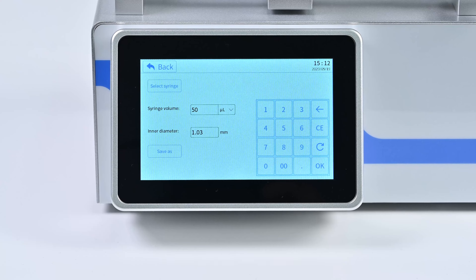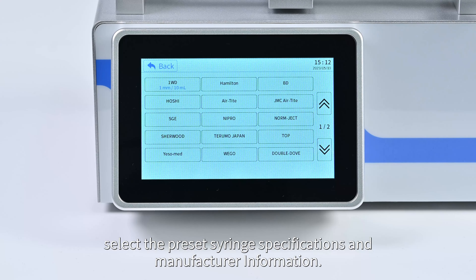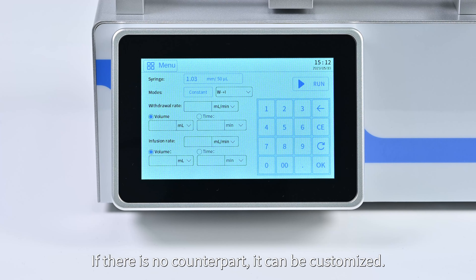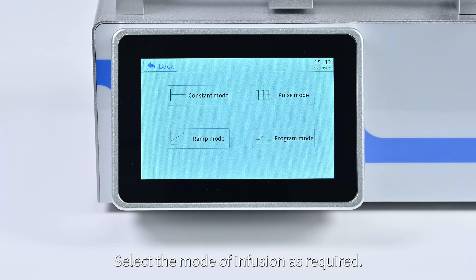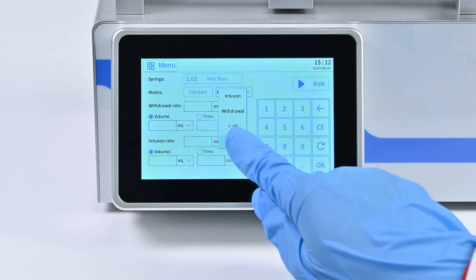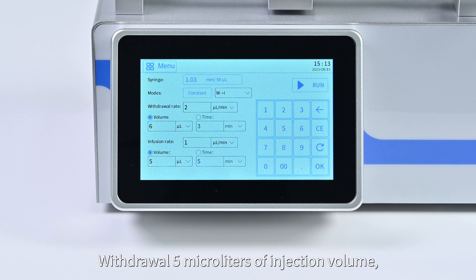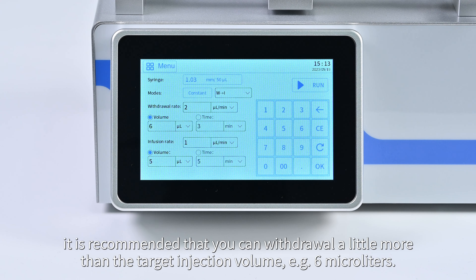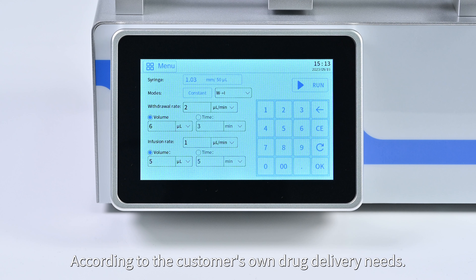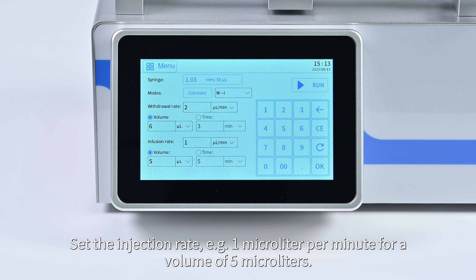According to the selected syringe, choose the preset syringe specifications and manufacturer information. If there is no matching option, it can be customized. Select the mode of infusion as required. For cannula administration, withdrawal of the drug before infusion is needed — select constant mode, withdraw five microliters of injection volume (it is recommended to withdraw slightly more than the target, e.g., six microliters). Set the withdrawal rate to two microliters per minute, and set the injection rate to one microliter per minute for a volume of five microliters.